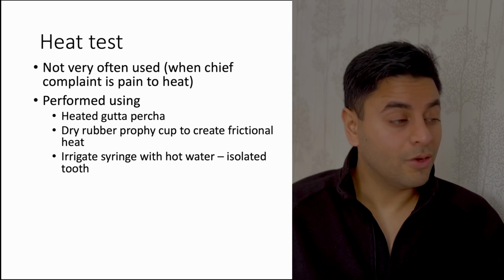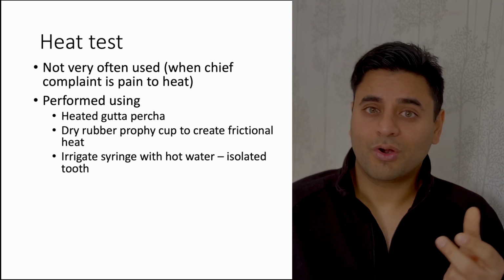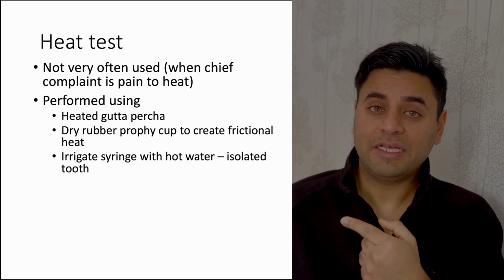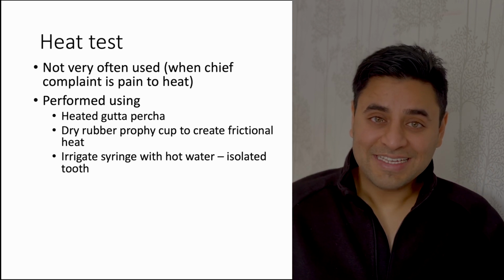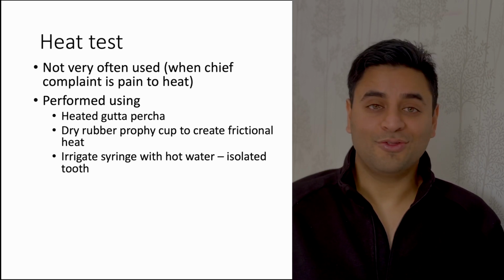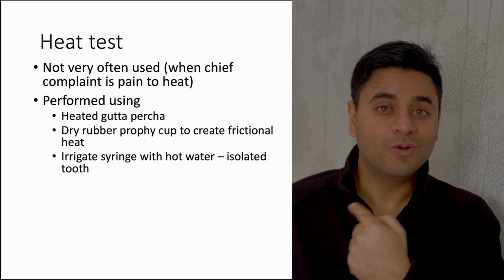Some people say you can use a rubber dam, and then irrigate hot water on it to find out if the patient responds. Now think about it this way: I'm going to give my patient local anesthesia to apply the rubber dam. How can I ever test if the tooth is vital or non-vital when the rubber dam is on? So this is not a very good test, unless that's the only lone standing tooth around there.